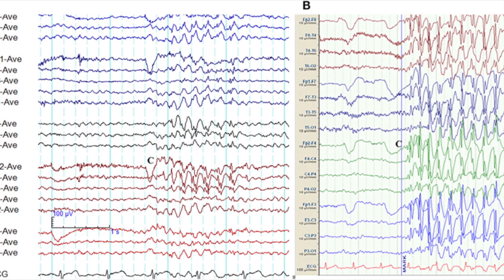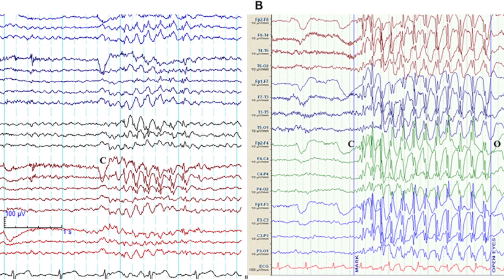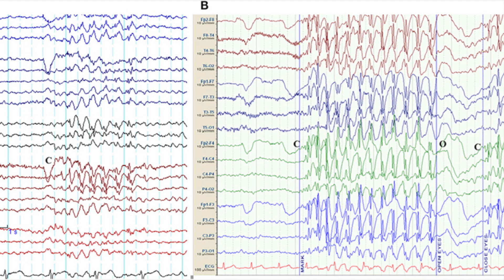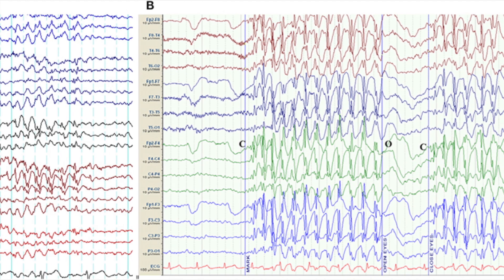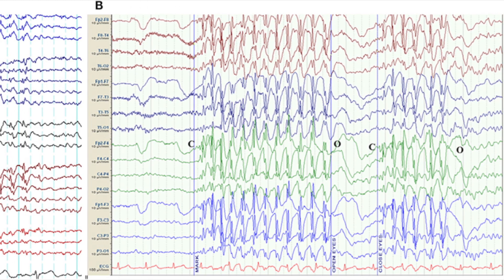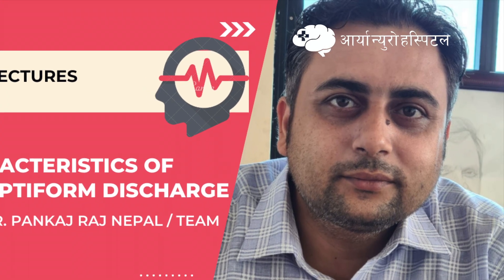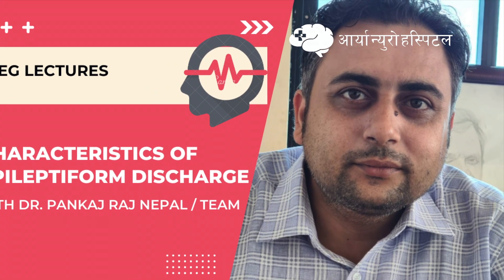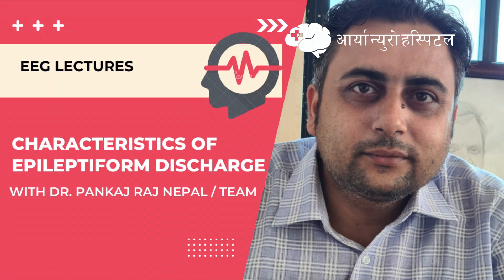The cardinal characteristic features of epileptiform discharges are polyphasic sharp waves with after-coming slow waves that clearly disturb the background and have a sensible electric field. Today we are going to learn about the characteristic features of epileptiform discharges noticed in EEG.